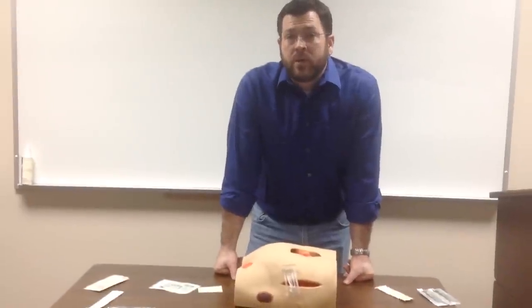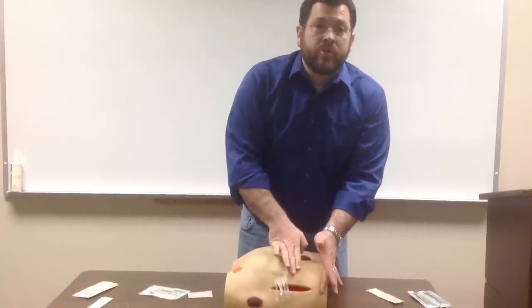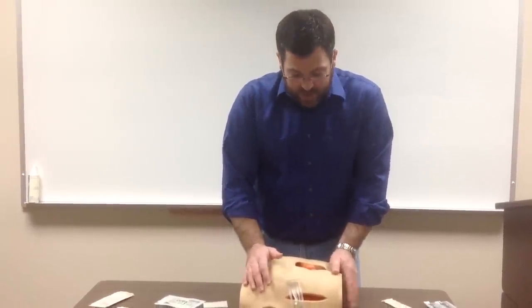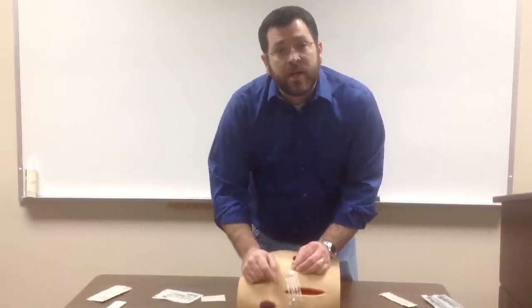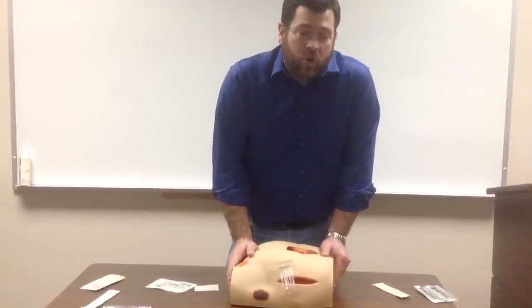Steristrips should be left on until they peel off on their own. If I'm removing sutures, I'll take out every other suture first to make sure it's not going to dehisce or pull apart. Then I'd take this section of sutures out and put steristrips on, then the next group of sutures out and put steristrips on — reinforcing the wound the whole way. If you take out all your stitches and then try to put steristrips on, there's a risk the wound could dehisce, especially in the abdomen where there's lots of pressure. The wound should stay together, benzoin should be on here, spacing should be very close together, and you should have lots of space on either side. Tell patients it's okay to get the wound wet to wash, but not to soak it, and to leave the steristrips on until they peel off on their own. As the edges start to curl up over a few days, just cut the curled edges off. When the steristrip comes off on its own, it's ready to come off.